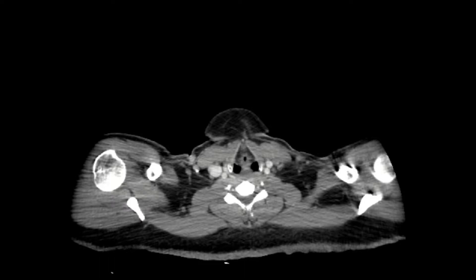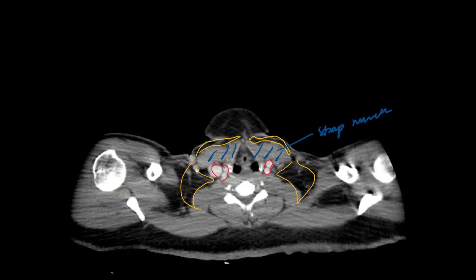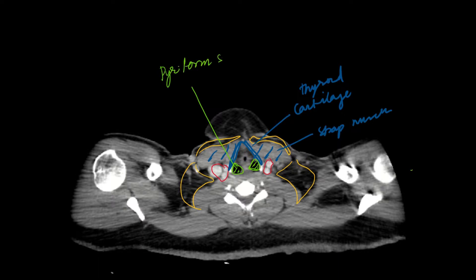Here you have the carotid space, then the posterior cervical space, and now the anterior cervical space. The strap muscles define this space. This is the thyroid cartilage. What you're seeing here — where fish bones and things get stuck — these are the piriform sinuses, two of them.